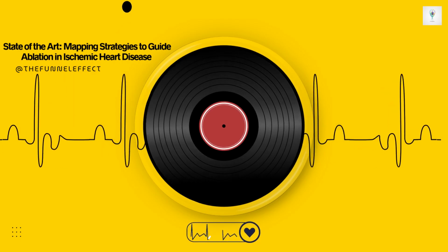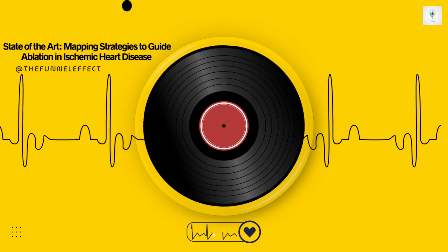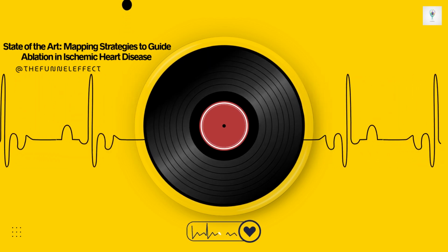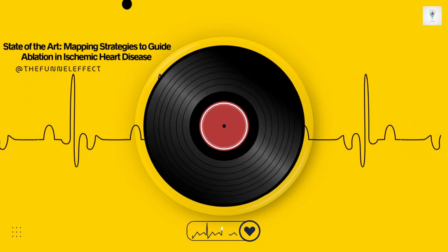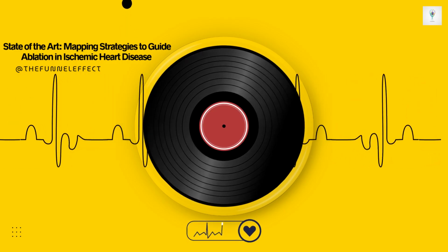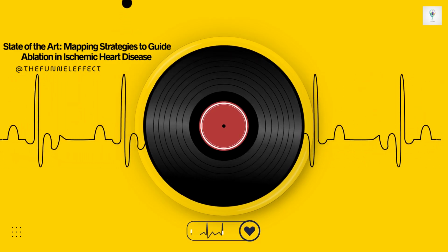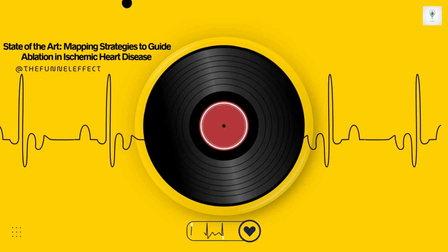Absolutely, that's the number one challenge. Many VTs, especially faster ones, cause a significant drop in blood pressure. This severely limits how much time you have to map before the patient becomes critically unstable. Operators might use rapid drug infusions, things like pressors or inotropes, just to try and maintain blood pressure for a few crucial minutes of mapping. In really severe cases, they might even need mechanical hemodynamic support, like an Impella pump inserted into the ventricle.